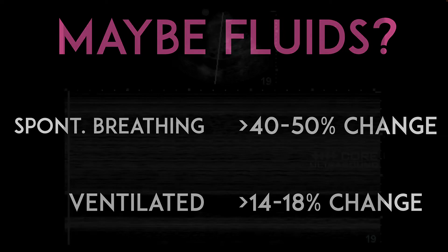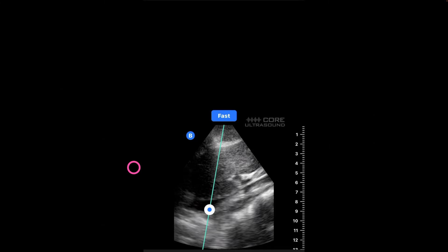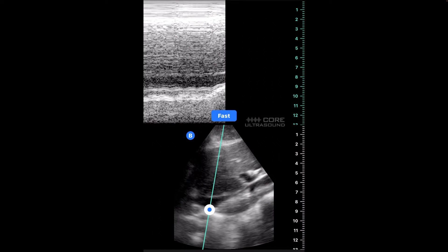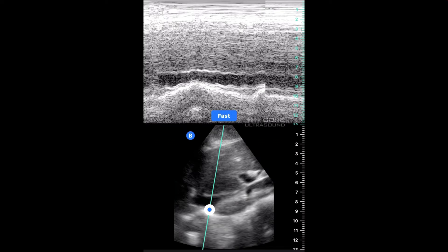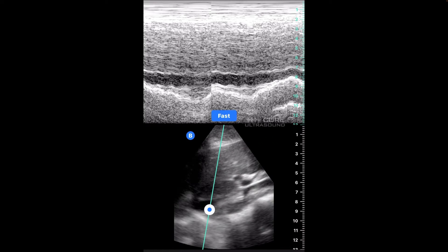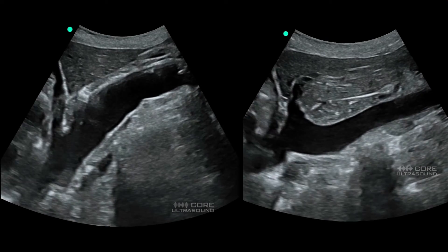Irrespective of how you utilize the data, please don't use M-mode to measure. The problem is the M-mode cursor will not move as the patient breathes — it doesn't have a homing beacon to stay at two centimeters from the junction. Watch what happens when the patient takes a big breath: we start out good, but the cursor ends up in a completely different area — towards the end we're actually looking at the right atrium itself. Use B-mode, hit freeze, and measure with calipers.